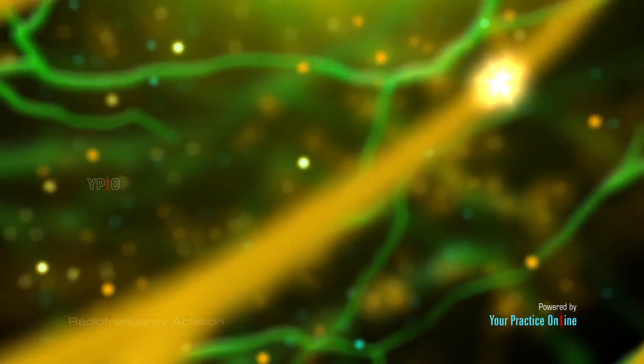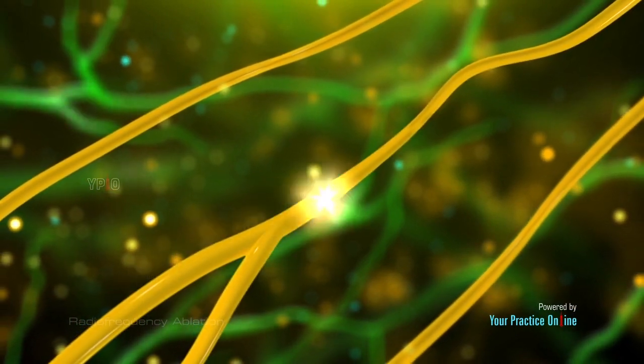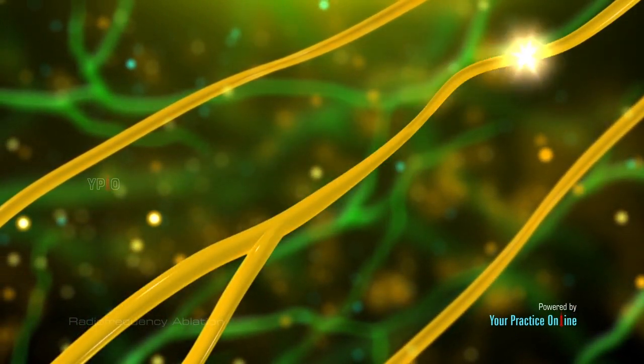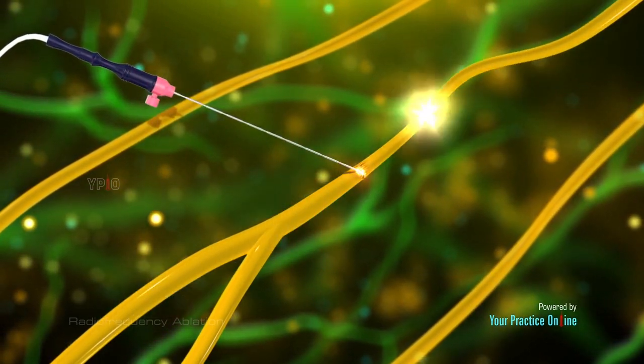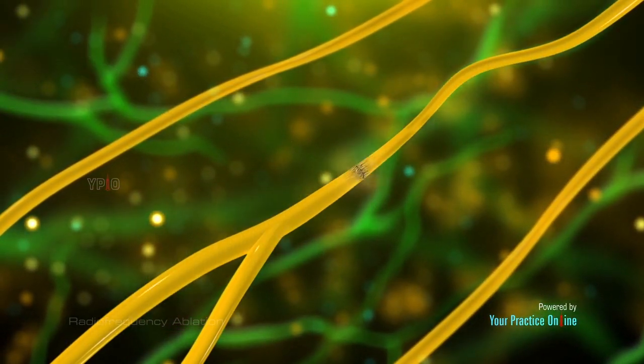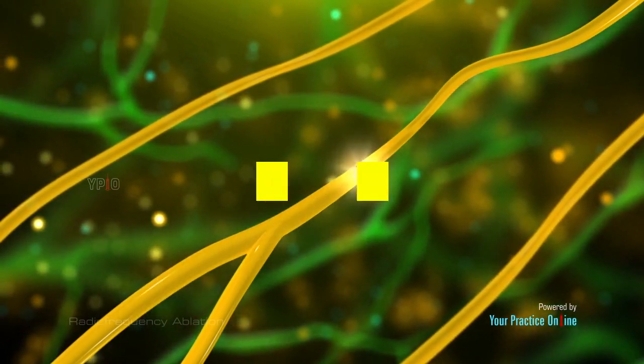Radiofrequency ablation, RFA, also called rhizotomy or neurotomy, is a novel non-surgical technique which employs radiofrequency waves to produce heat that damages the nerves transmitting pain signals to the brain.